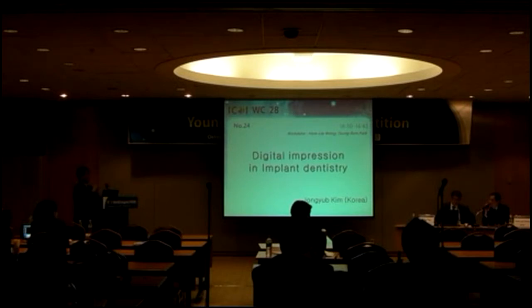So your comment on digital impression today is that you cannot use a prefabricated part. Right. What other limitation do you have? I don't think too much about complications or limitations in digital impression, because if you can just open the mouth, you can still scan. But for implant cases, the most disadvantage of using digital impression is reflection.